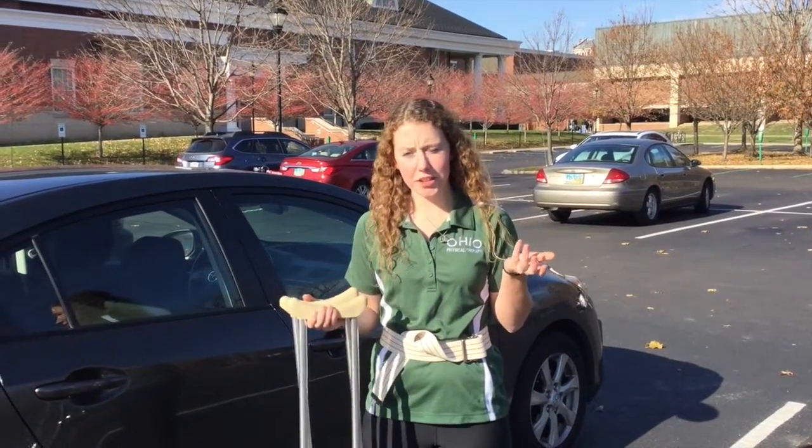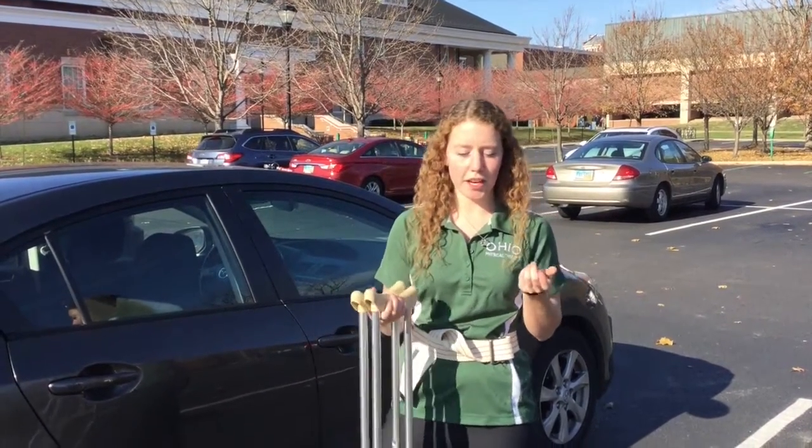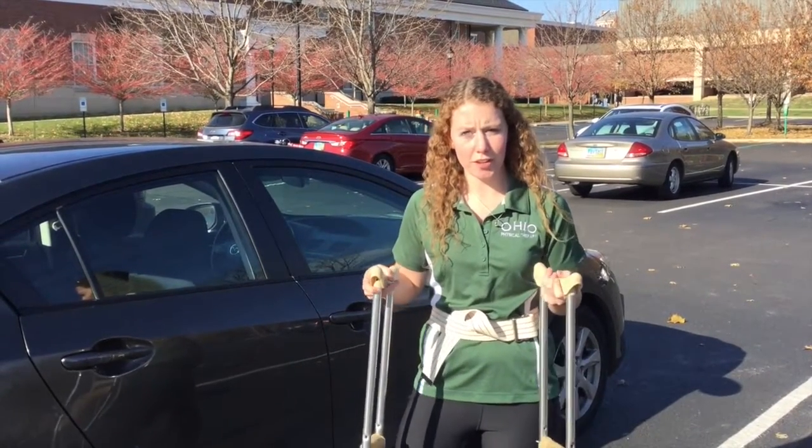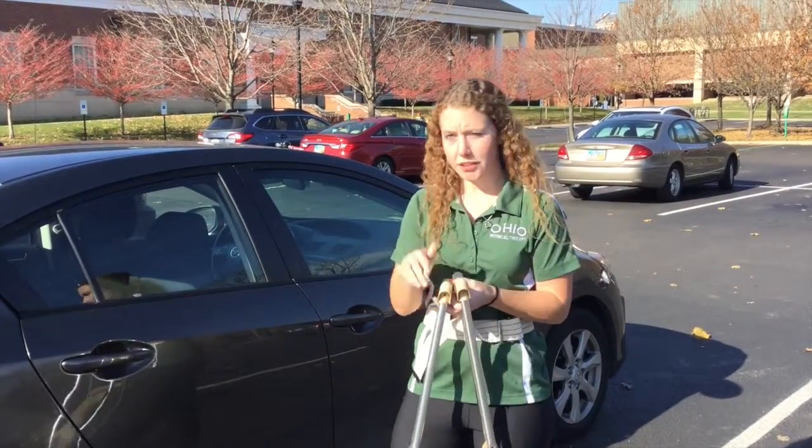Be demonstrating skill 43, which is car transfers. So I'll be demonstrating how to get into and out of a car using axillary crutches and non-weight bearing on one lower extremity into a sedan.